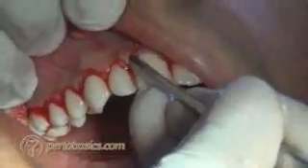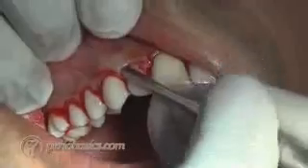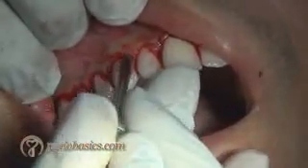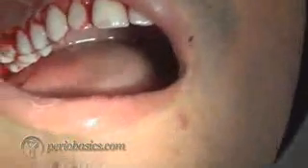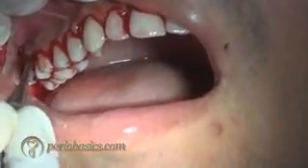Then we reflect the flap. Now you can see that I am reflecting the flap. Using the periosteal elevator, I have tried to first elevate the interdental papilla and then I'll try to reflect the flap on the buccal aspect of the teeth.